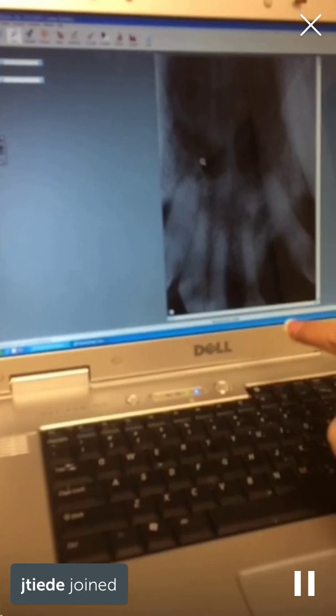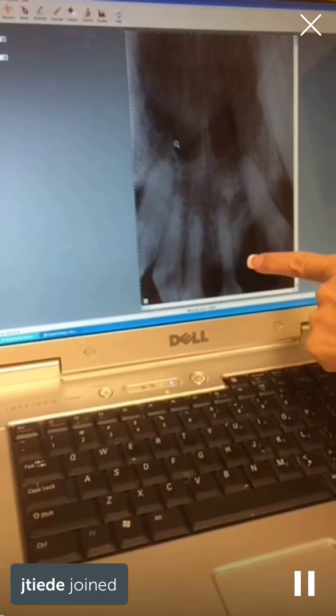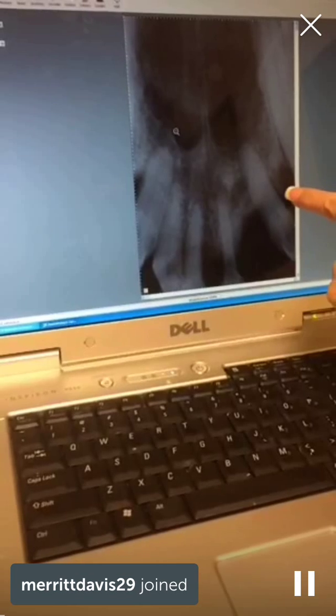X-rays first. So we had 8 teeth that needed to be extracted and a lot of changes. This is actually the maxilla, the upper jaw. Normally the bone meets all the way down through here. We have some vertical and horizontal bone loss here, a little bit of vertical bone loss here.